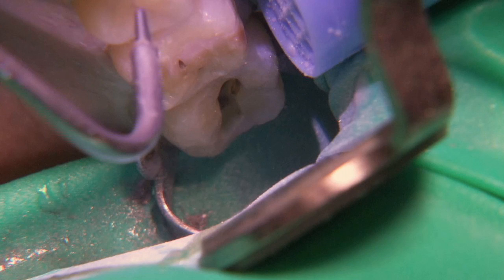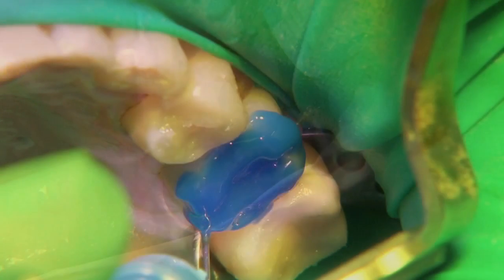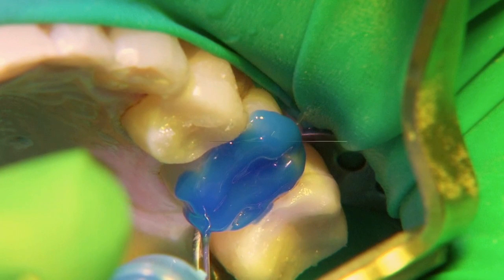We then acid etch the teeth and put them in. Usually we do every other one.